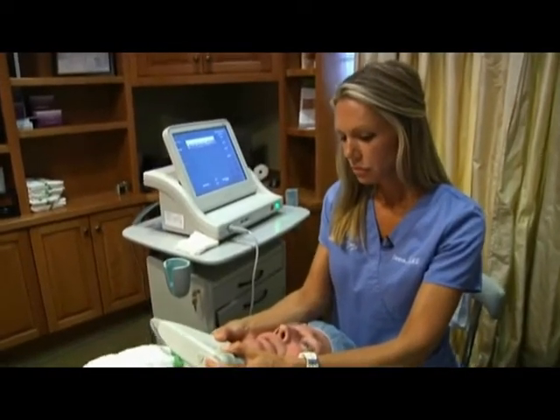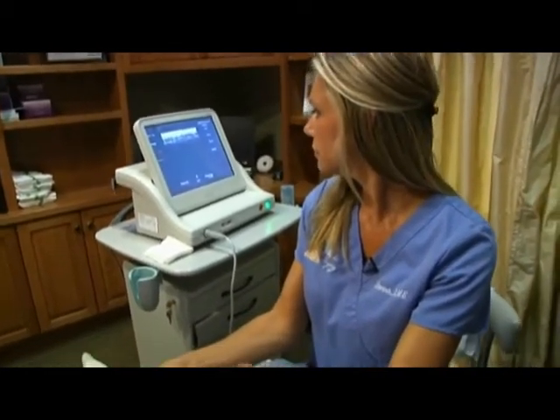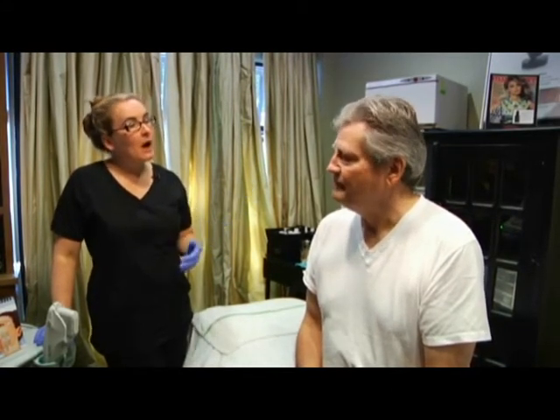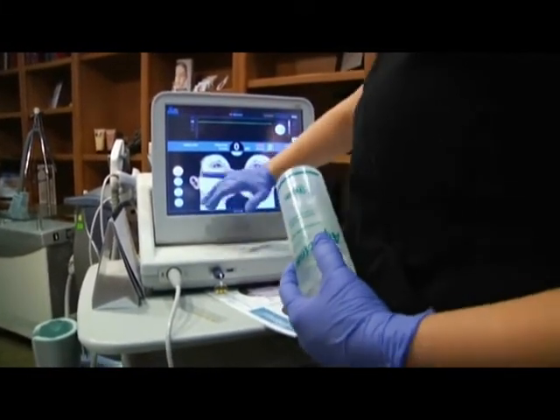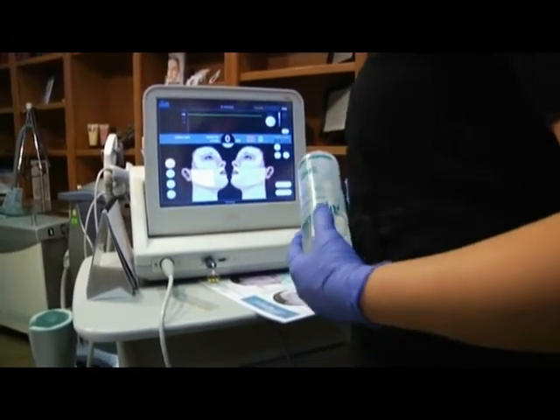In the past, we were treating that SMAS. We were treating the deep tissues and getting that deep tightening effect. Now we can treat just underneath the skin, 1.5 millimeters under the surface, so we get a surface tightening. I'm not going to promise that it'll eliminate all wrinkles, but it smooths them out a great deal, and we can get much more remodeling of that collagen just underneath the surface, so we get even more smoothing effect. We're going to do little sections all the way there, then some on your cheek, on your mouth, and then a little down your neck.